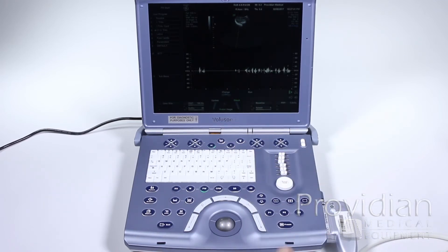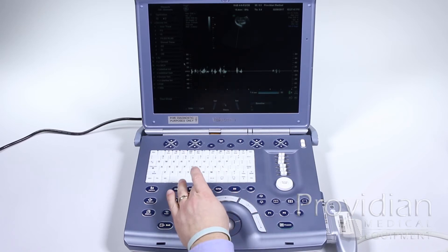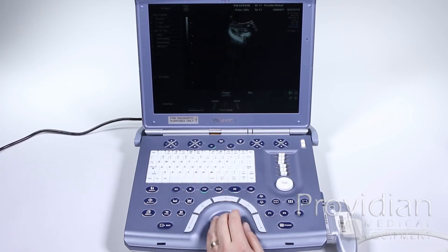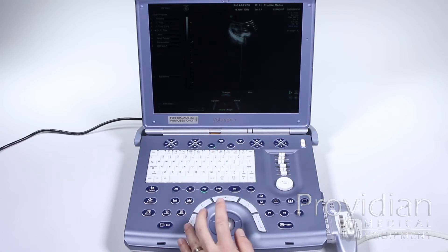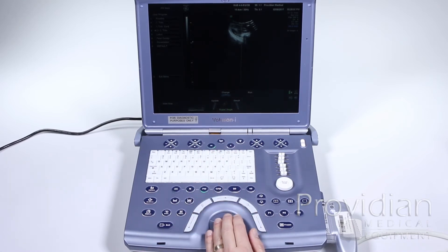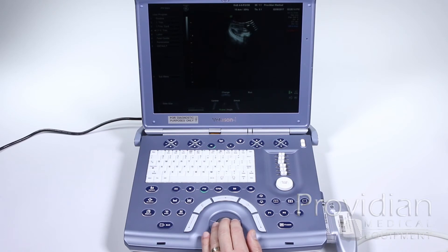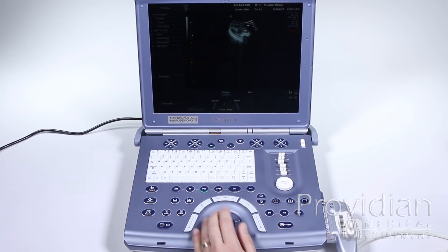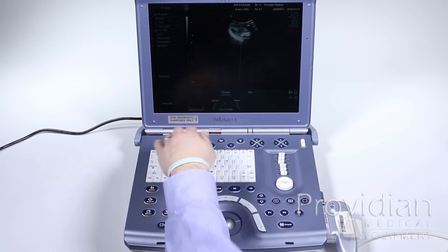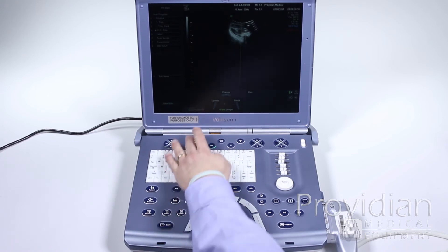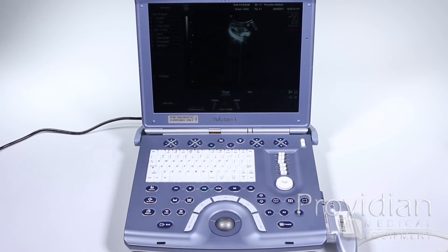You can also use color pulse wave and 2D together to get triplex mode. Going back to PW — we can change the size of the gate or angle using the trackball. The gate size can be adjusted for how large you want that gate to be. There's also audio, and you can change the volume by pressing the volume buttons once you're in live mode.